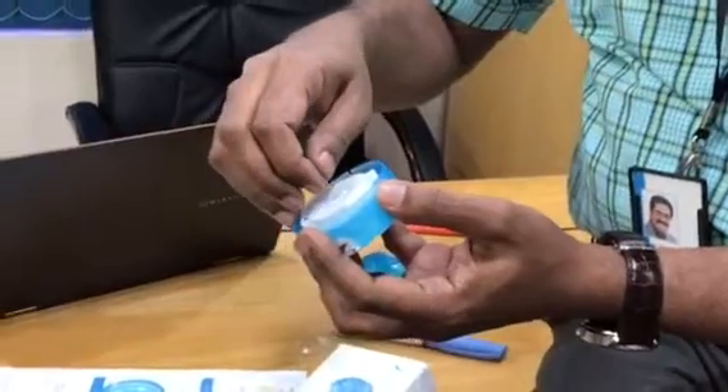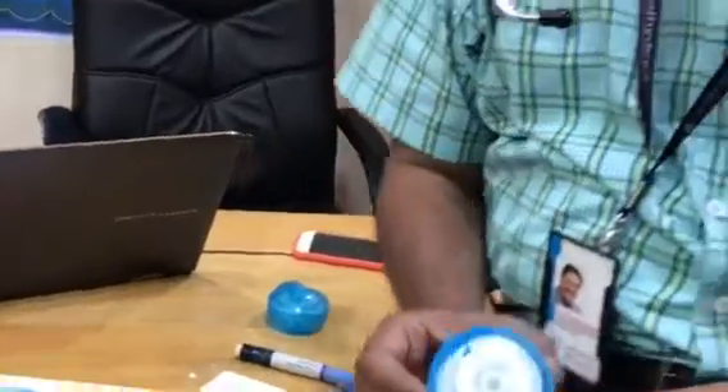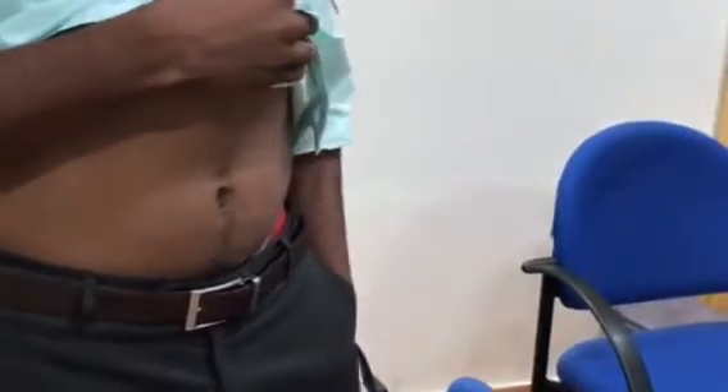This is the adhesive tape, and this is the cap over the needle which I have removed. If you are on four injections per day, this is going to be a blessing for you, I promise.